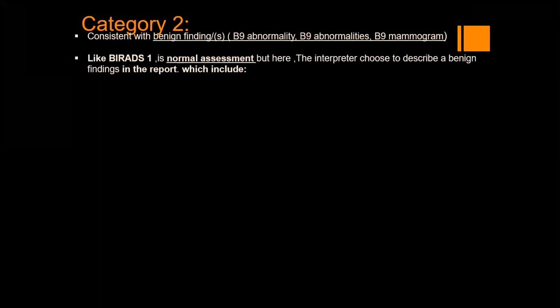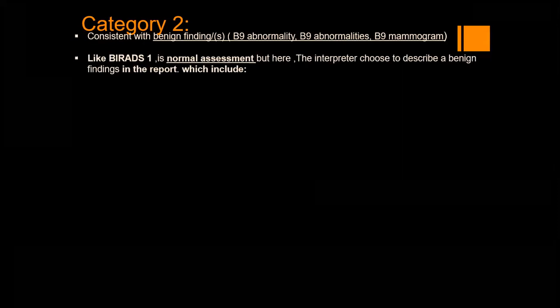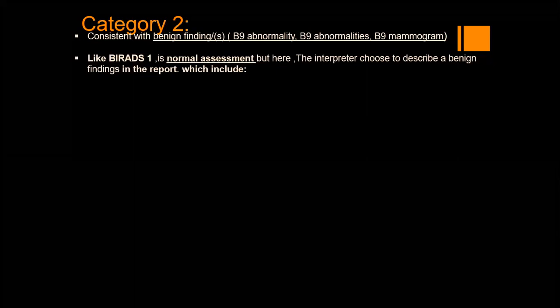Fat containing lesions, benign calcifications. Benign calcifications like? Skin calcification, vascular calcification, secretory mastitis, popcorn, involuting fibroadenoma.